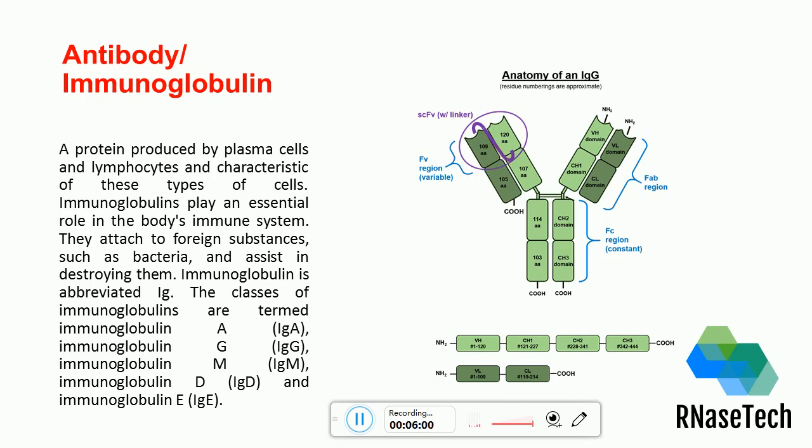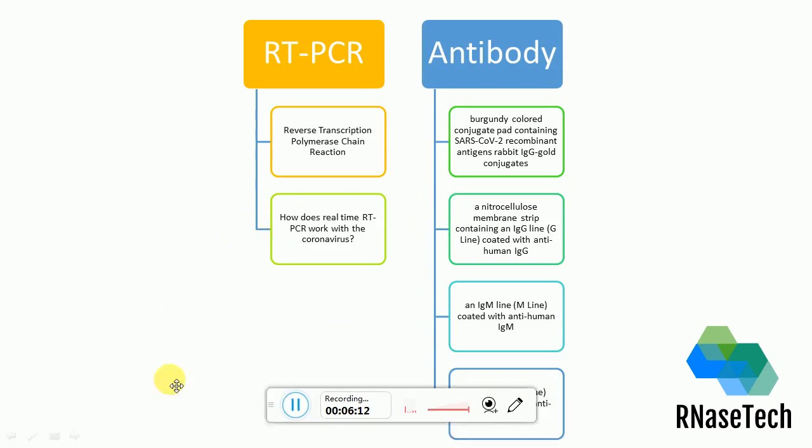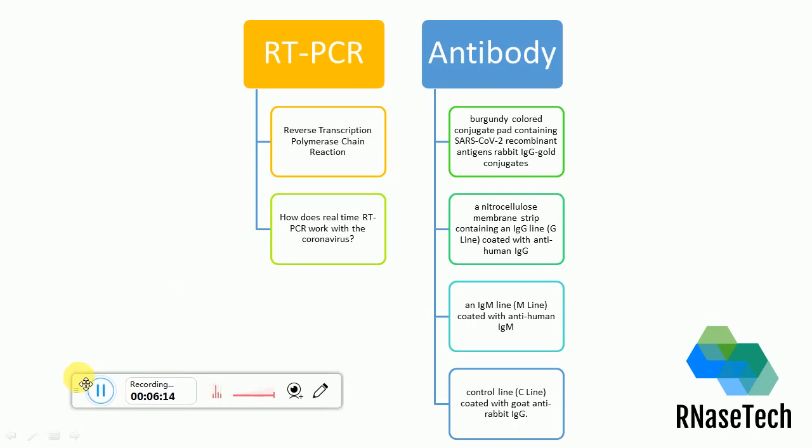Okay, so moving further, now this is the diagnostic process or concept which I want to explain, what is happening on the PCR, or what is happening on the diagnostic kits.